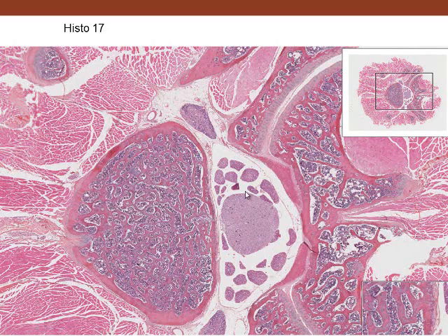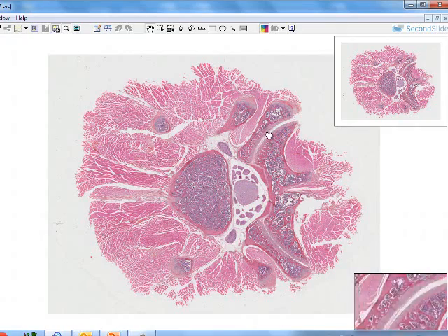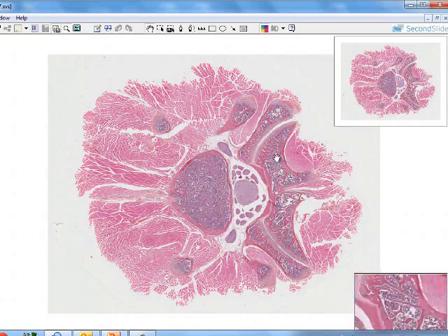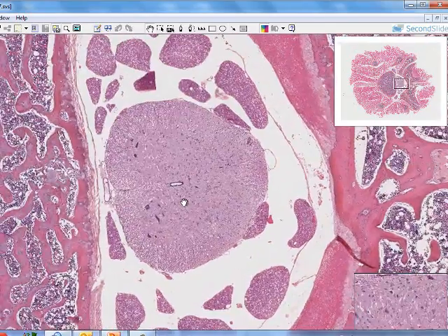So if we look at the spinal cord, this is the vertebrae that comes around here, muscles associated with it, but the spinal cord, and these are some of the spinal nerves that are coming out. This is the spinal cord and some spinal nerves in through there, and these are bones. It's bones here and here. We see bone marrow here and here. These are vertebrae, and then these are muscles that are attached to it.